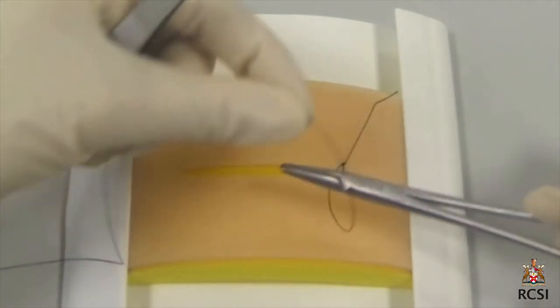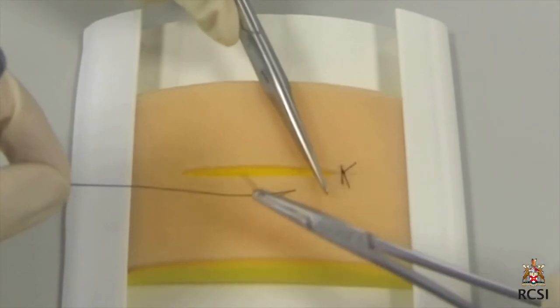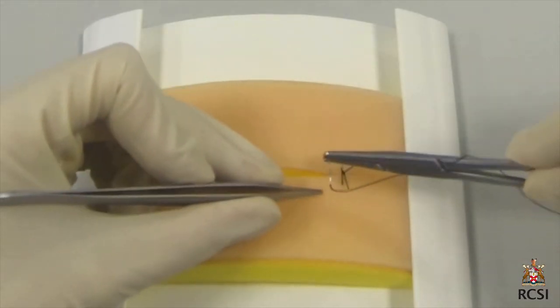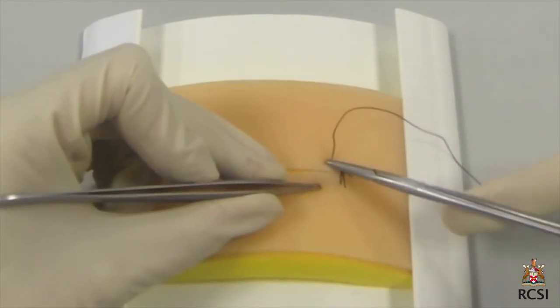To prevent this first knot loosening, it is locked by pushing the short end abruptly back to where it was. A secure reef knot is then performed to secure the surgeon's knot. The suture is cut with the tip of the scissors.